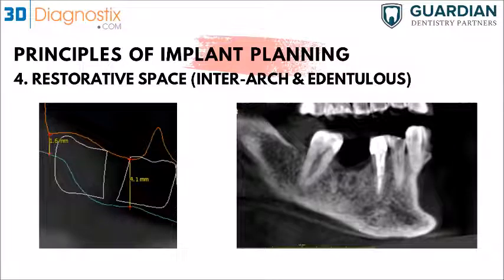And then what we can do also, once we've got the patient's records, is see that sometimes it could be really difficult to place a sleeve that, let's say, for example, is 5 or 6 millimeters wide. Because if it's that wide and there's too much drifting of the molar, and the restorative space is less than 5 millimeters, then the metal sleeves would have some contact with the mesial crown of number 31 here, and the bicuspid. So it's going to be difficult to seat the guide unless you get rid of that contact or that interference.